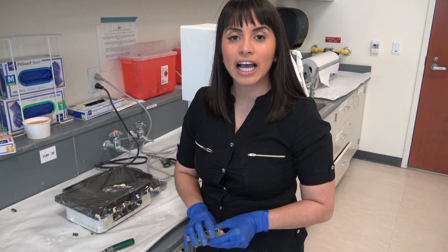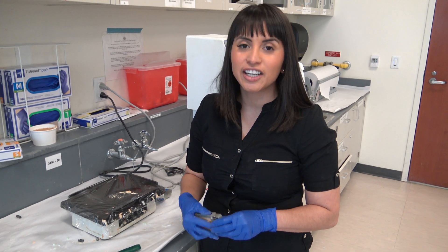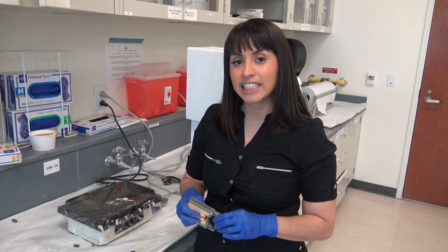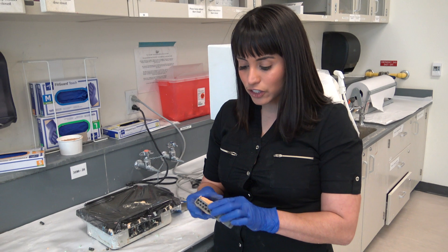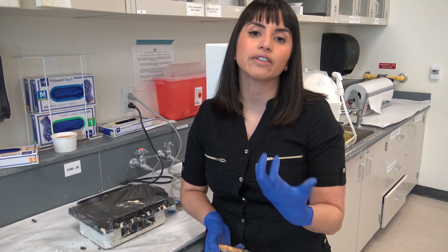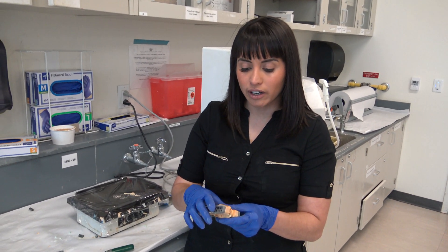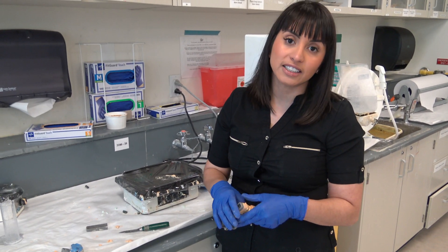Thanks for joining us today on how to pour up and mount a triple tray on the monotrack articulator. Although this was not for a die-prepped impression, you can use the same technique for any crown that you do — or if you only need to do a wax-up, or you need to see if you have proper occlusion, especially for juniors doing crown preps in two appointments. This is a great way to quickly verify everything and pour it up. You can use it as diagnostics to talk to your faculty with.